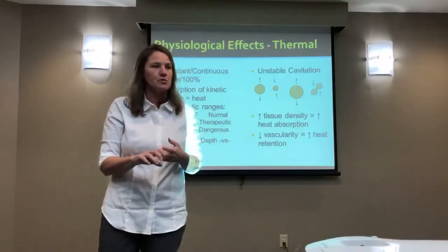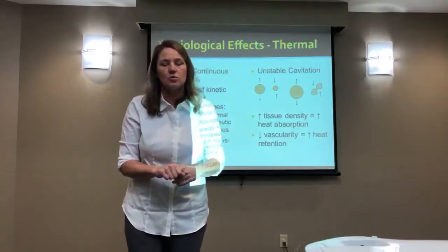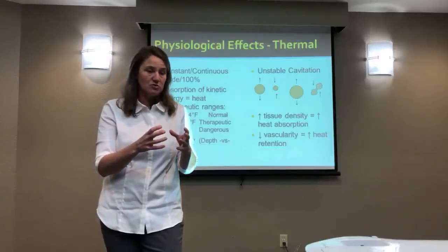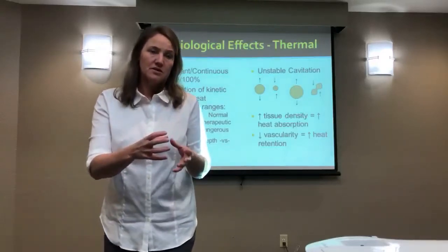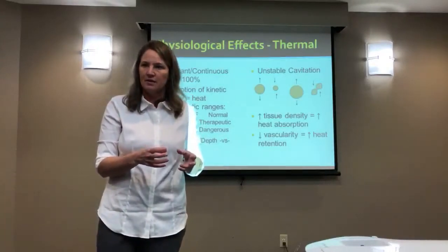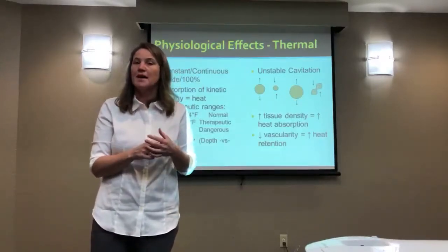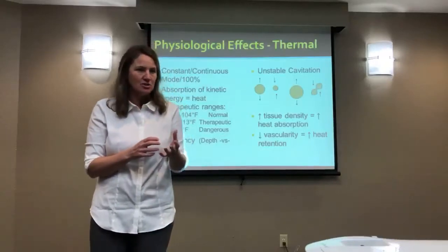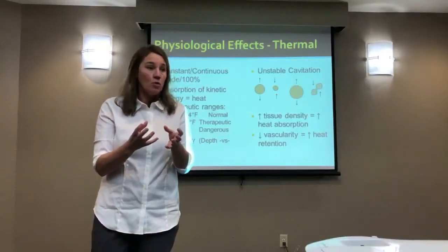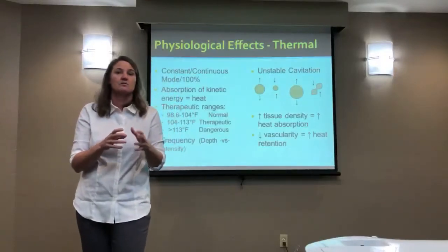Same with a joint capsule or a ligament. So those types of tissues. When you look at research studies as well, the nature of the collagen that's in those connective tissues make them more absorbent. So I like to think of it as sort of the rubber in the bottom of your shoe that is energy absorbing. The type of collagen in those connective tissues, they're meant to absorb energy. That's what they're designed to do. That's what their job is. So when you think about it, they absorb more energy. So you can target them more easily, and they're going to absorb the heat more.